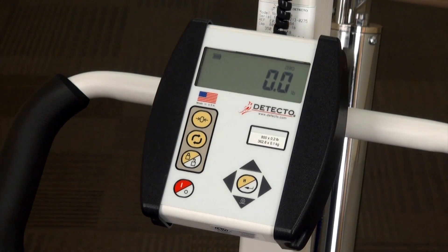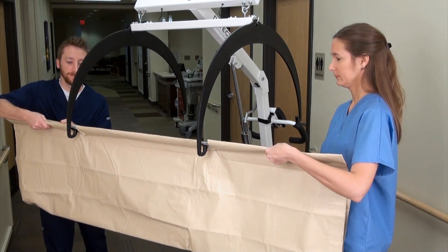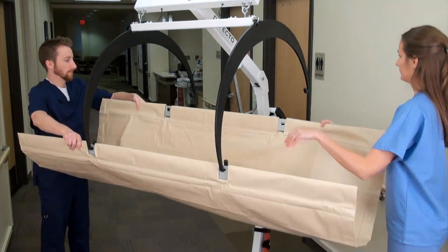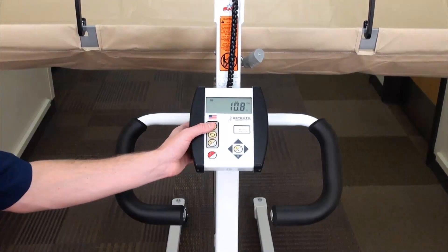Turn on the indicator and press the zero key. Attach the stretcher to the hoops using the support bar holes. Once attached and the stretcher weight is established, press the zero key again.